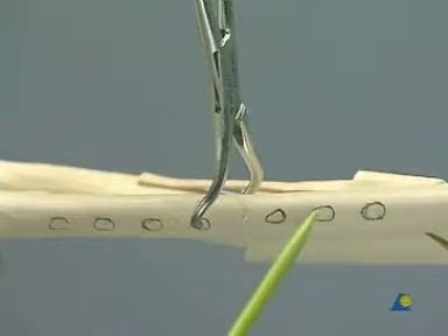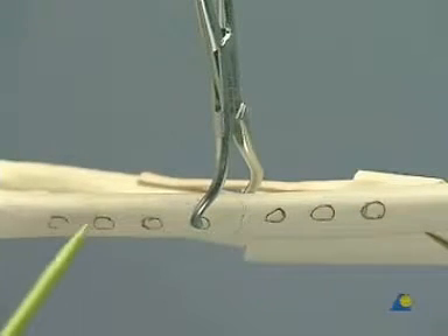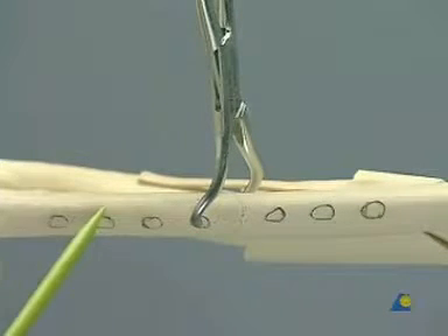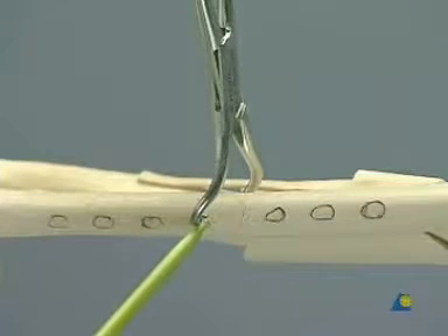The first plate hole will be drilled proximally followed by the distal load hole as shown. These screws will hold the fracture while the lag screw is inserted.